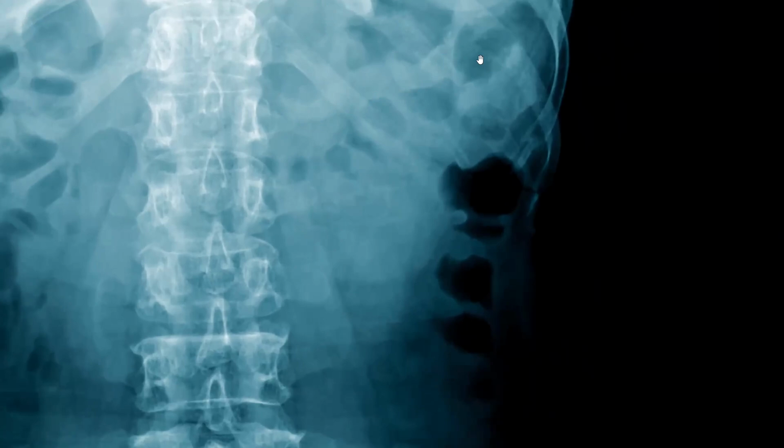Okay, and one thing I can point out anatomically, whenever you're looking to find the transverse colon, one thing is to find the stomach. Okay, immediately below the stomach, you'll be able to find the transverse colon. The reason for that is because there is a gastrocolic ligament, okay, which attaches the inferior margin of the stomach to the transverse colon. Okay, so if you're having difficulty finding the transverse colon, look for the stomach, look for its inferior margin, look directly below that.